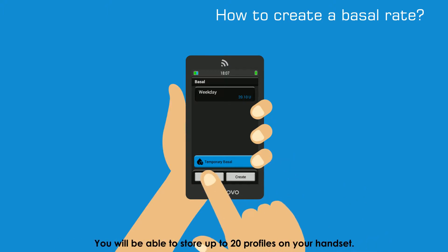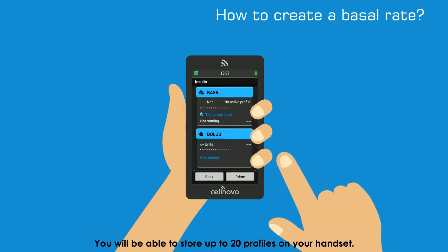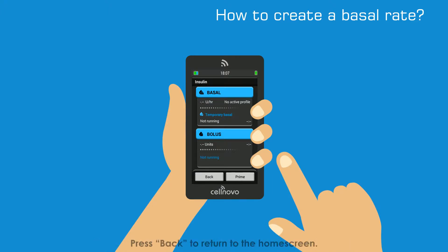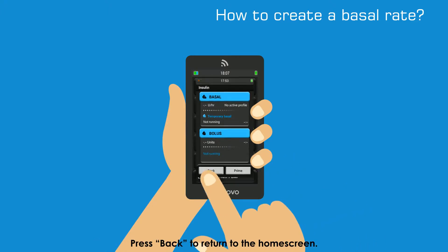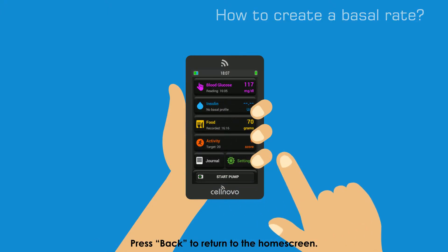You will be able to store up to 20 profiles on your handset. Press Back to return to the home screen.